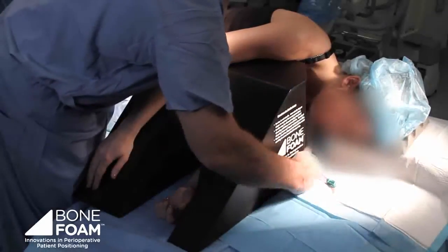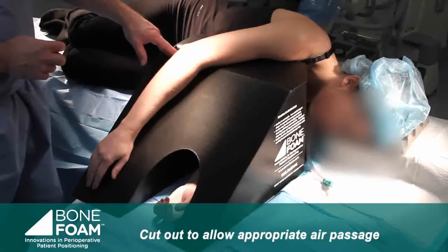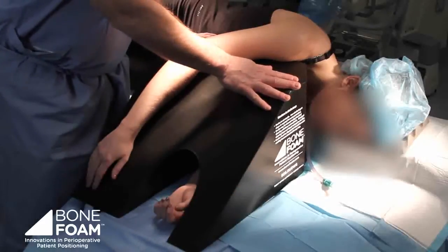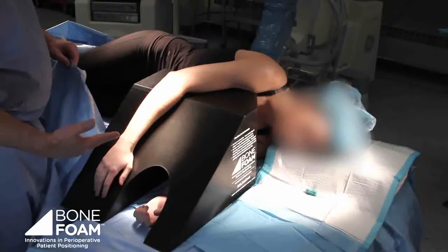Again, it has the cutout, which then allows for the endotracheal tube to not compete with the wedge positioner. These come in different sizes as well to accommodate both small and large frames. The upper extremity wedge and block in this case are under the drape, and I almost always use it that way. Conceivably, one could bring it in over the drape, but what I do is simply drape out the wedges in this fashion.